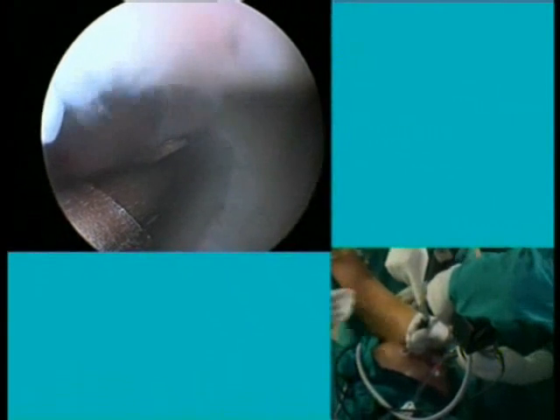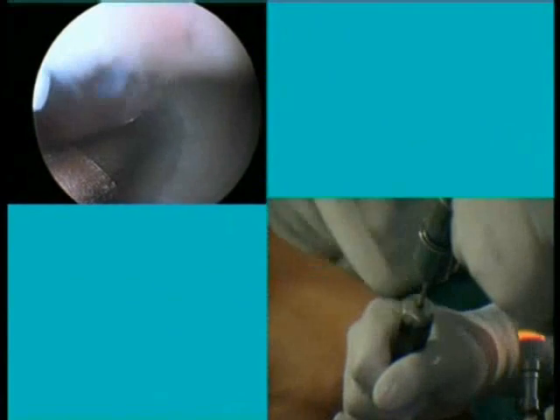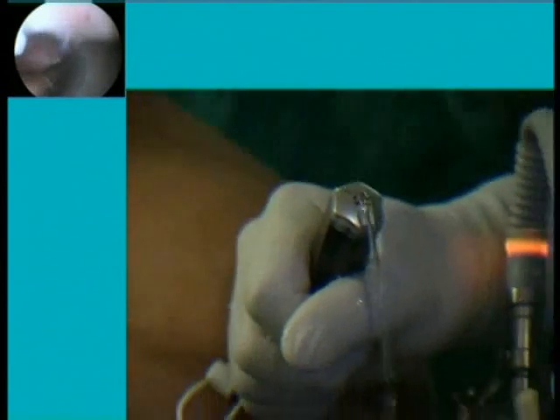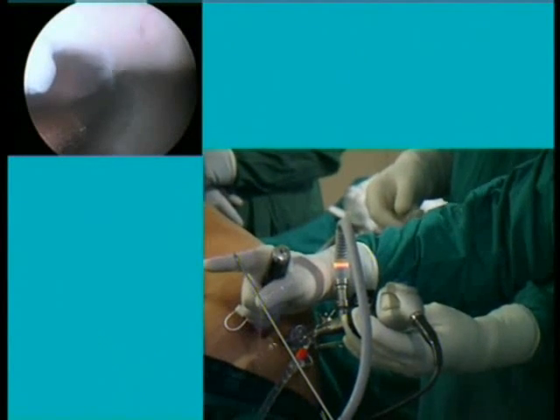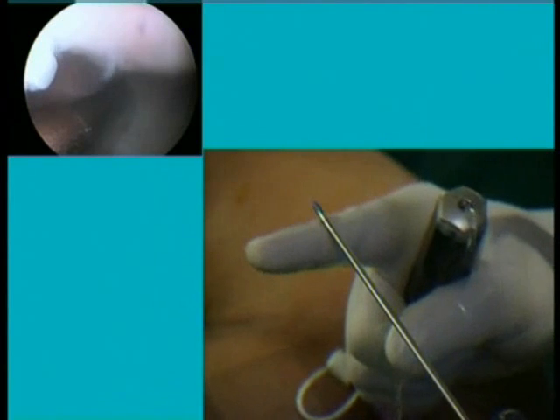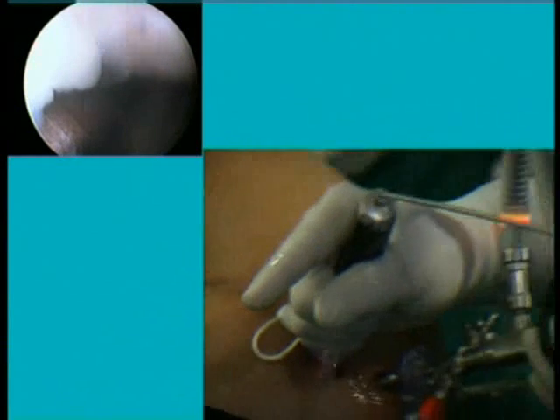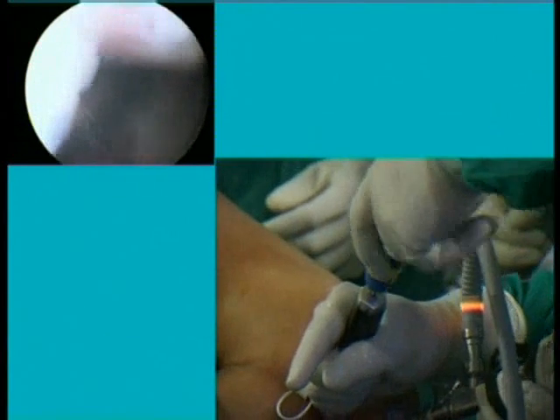Sanjay, we can't unfortunately see it. Any chance you can rotate it? Is it slightly focused? Oh, yeah. Yeah, that's much better. Thanks. So you just need to open it up, and these are self-tapping anchors. Can you see this anchor now here? Yeah, can you zoom in a bit more, please? On the tip, please. Okay, great. It has a laser mark here, and it has a laser mark at the outer end, so you can very easily see. So this is 2.9 millimeter. 2.8 millimeter.